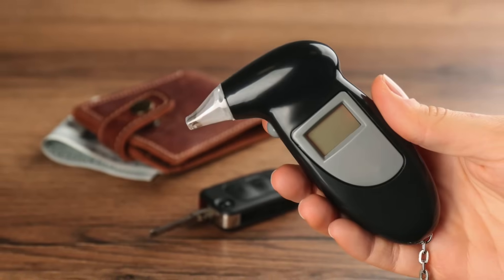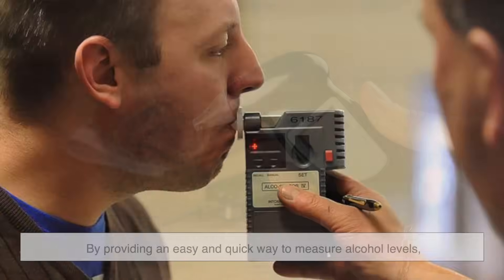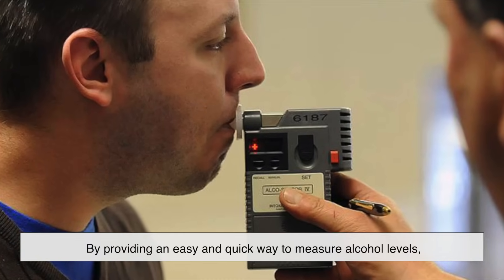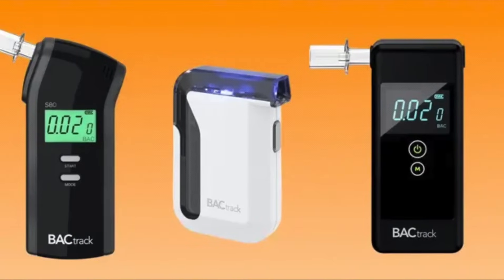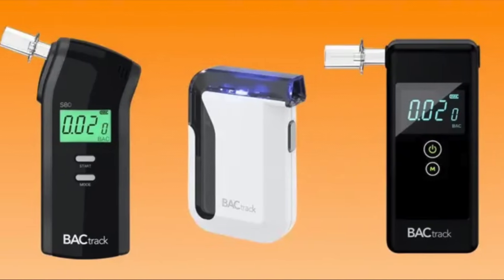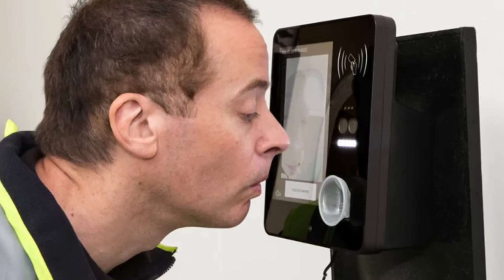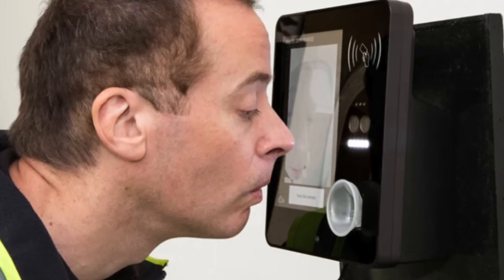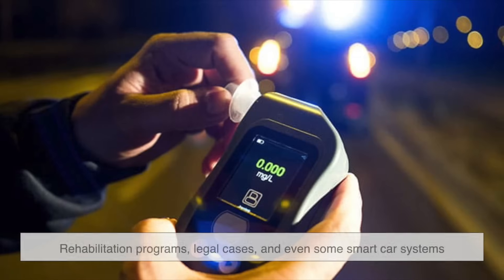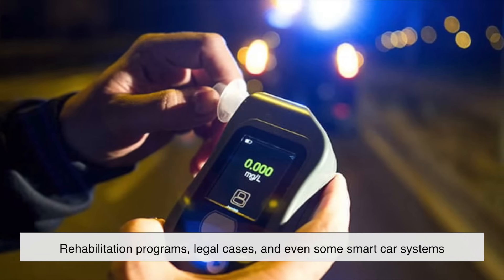Breathalyzers are an essential tool in preventing drunk driving, one of the leading causes of traffic accidents worldwide. They provide a quick and easy way to measure alcohol levels, helping law enforcement keep roads safer. Personal breathalyzers are also available for individuals who want to monitor their own BAC before deciding to drive. In some cases, breathalyzers are used in workplaces — especially in critical safety industries like aviation or heavy machinery — as well as in rehabilitation programs, legal cases, and even some smart car systems that prevent intoxicated driving.